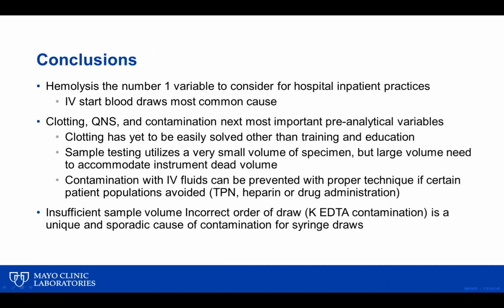So we've discussed the 3 phases of the testing process and how any one of those phases can result in a testing error. However, the data suggests that the pre-analytical phase is really the most susceptible to these errors. And one of those errors can result from hemolysis. And this is true for both inpatients and outpatients, but today I focused on the inpatients.